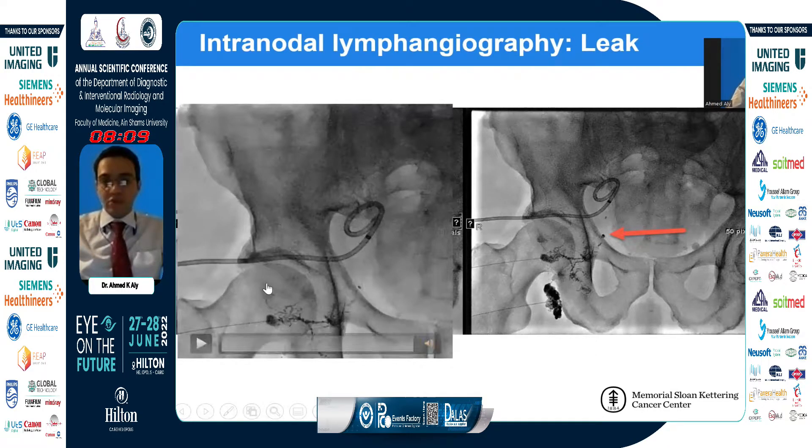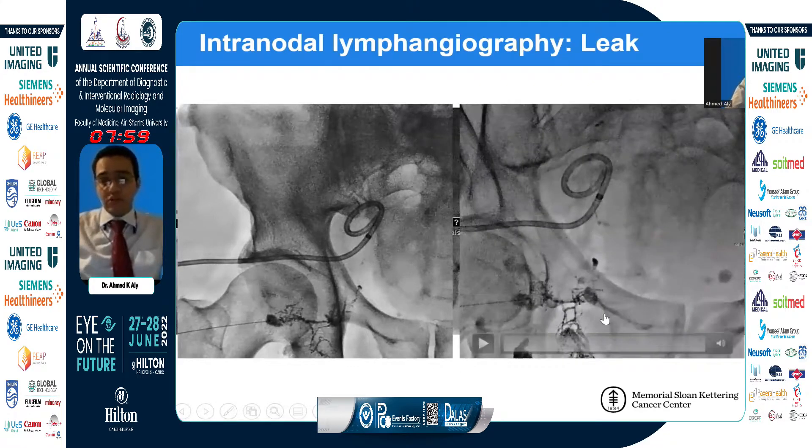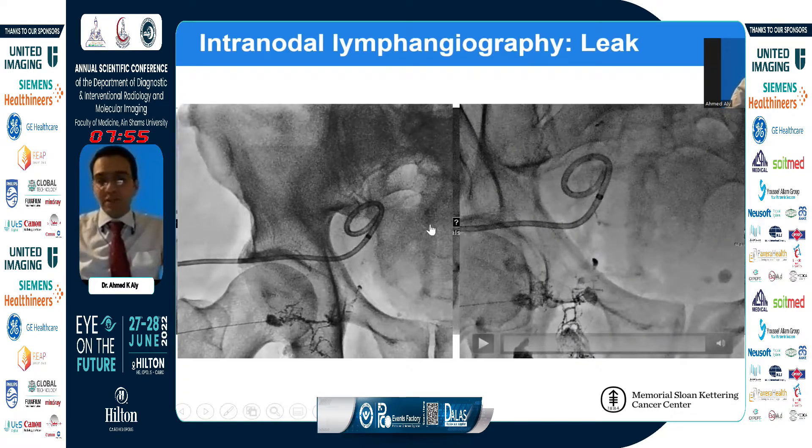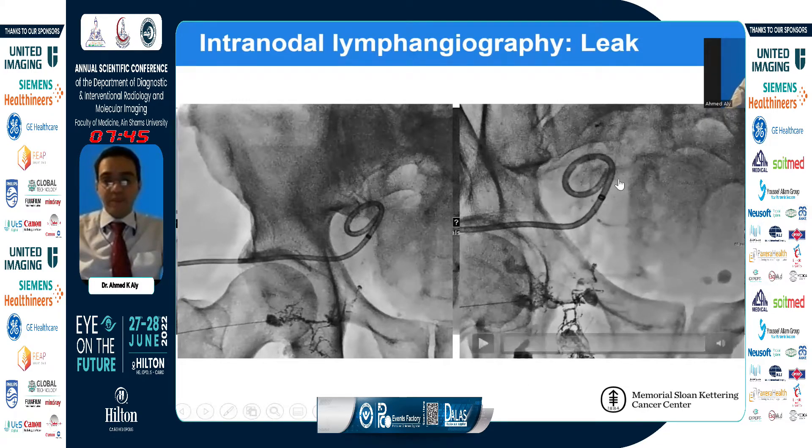Once you identify a leak, here is what it usually looks like: accumulation of contrast in a globular pattern. You can confirm, in cases of lymphocele for example, that the leak is within the lymphocele by injecting saline through a pre-existing pigtail drain and observing its effect on the accumulated lipiodol. Sometimes when you aspirate, you even see lipiodol coming out of the drain, confirming this is the responsible leak.